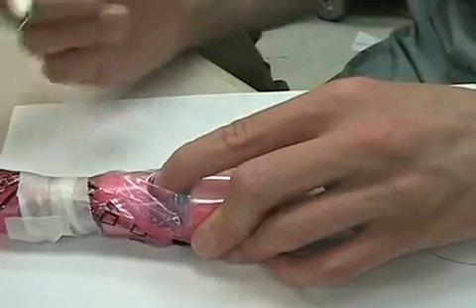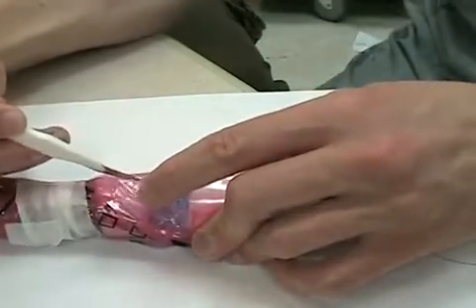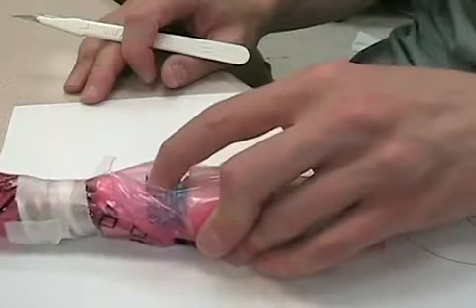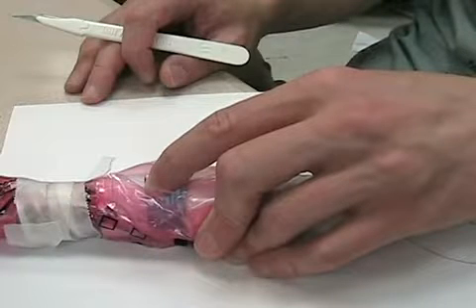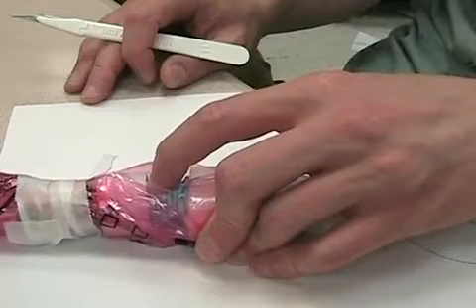Once you've identified those landmarks, grab your number 11 scalpel and cut from the thyroid all the way down to below the cricoid — that's your skin incision. Get your finger through the skin and feel the cricothyroid membrane again with your index finger. From this point on it's all feel. You don't have to see anything — you can do this with your eyes shut. In fact, sometimes there's going to be so much blood in there that that's essentially what you'll be doing.